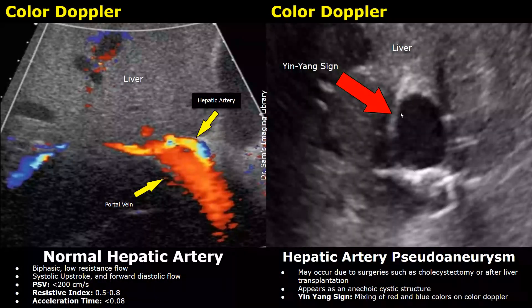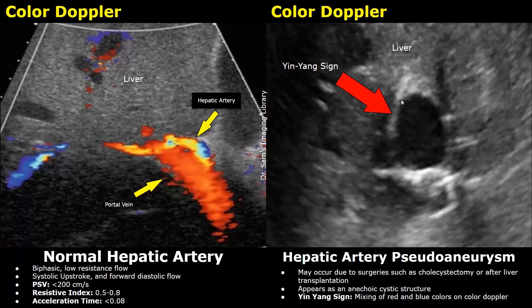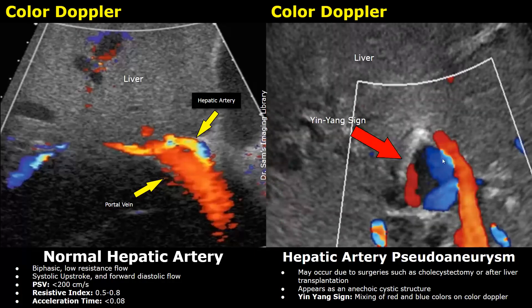Hepatic artery pseudoaneurysm is a rare complication of liver transplantation, and may rarely occur in cases of cholecystectomy or other surgical procedures. A pseudoaneurysm mainly occurs due to injury — there is a rupture in the artery and blood gets collected at one location, appearing as an anechoic cystic structure. On color Doppler, the cystic structure will show color mixing; this appearance is called the yin-yang sign and is often associated with aneurysms. One way to differentiate a pseudoaneurysm from a true aneurysm is by correlating findings with the patient's history. Pseudoaneurysms usually occur from recent surgeries such as cholecystectomy or liver transplantation.